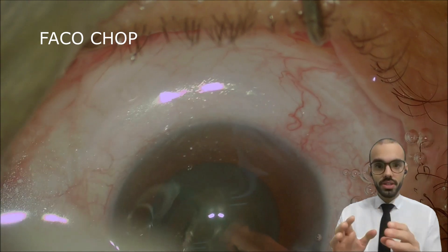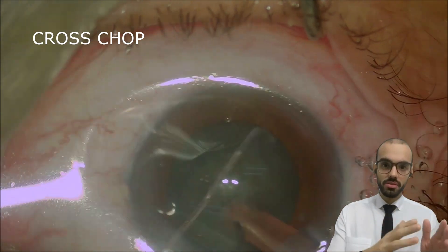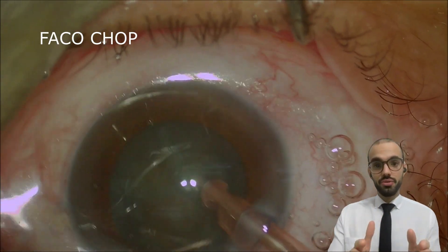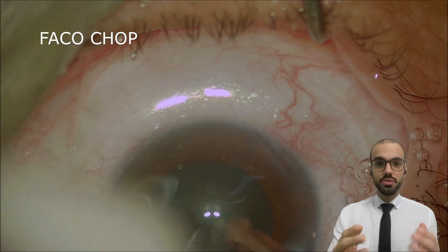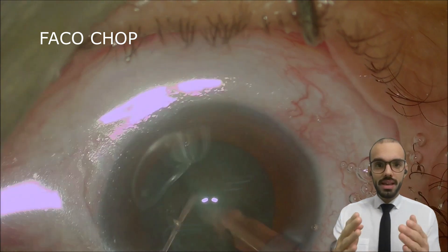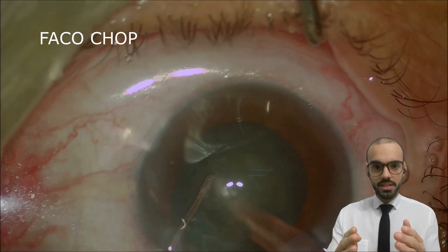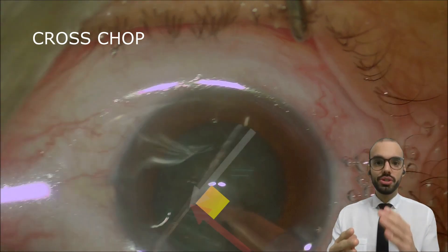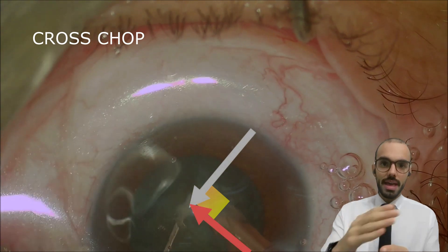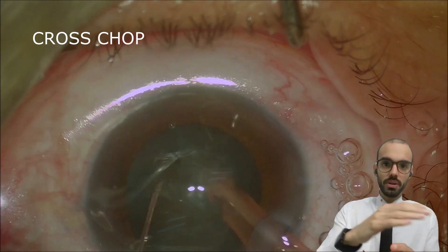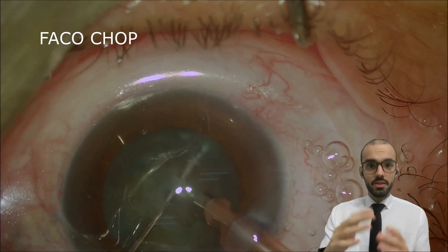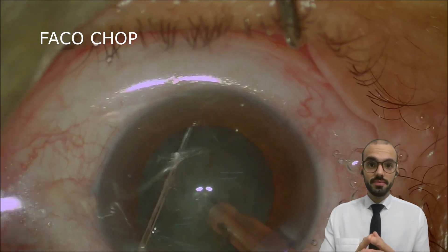In this surgical video, the patient does not have weak zonules, but I used the Cross Chop technique just to give an example. If you pay attention at this moment, I place the chopper perpendicular to my tip and bring the point of the chopper to the point of my tip, performing the Cross Chop technique.